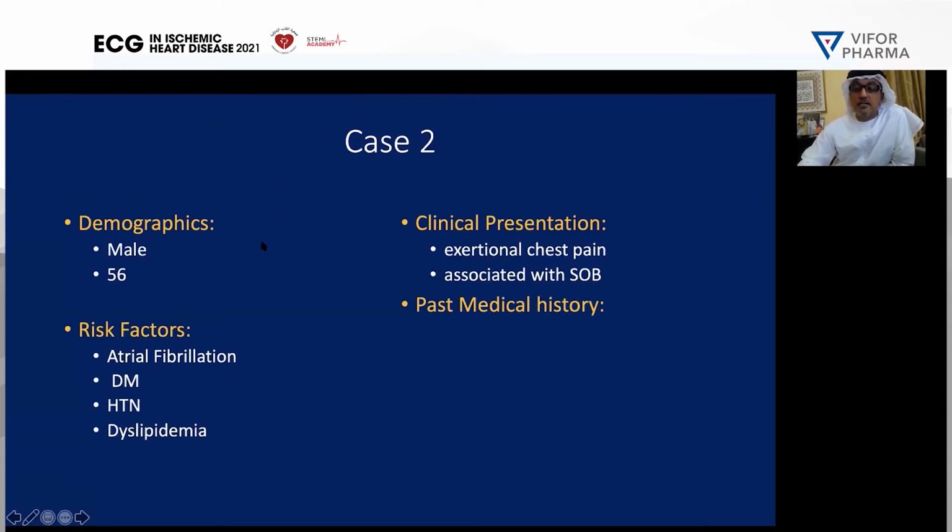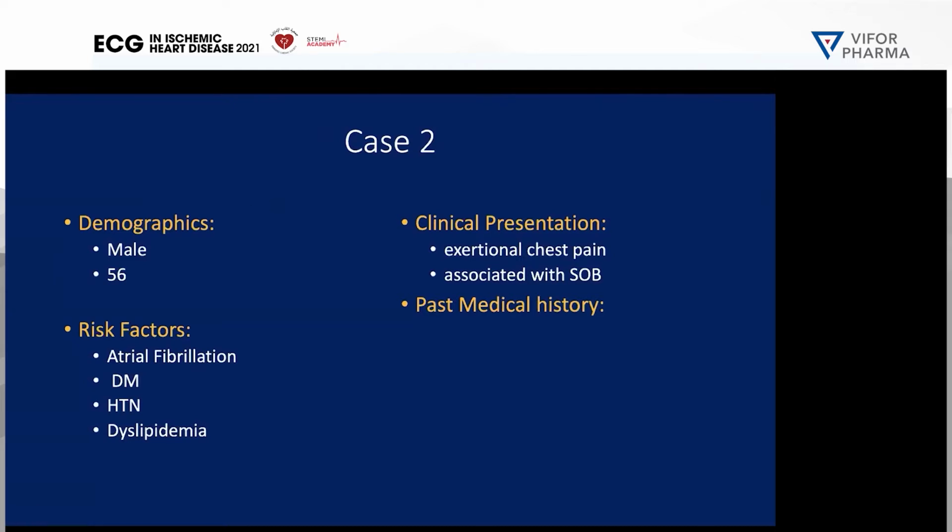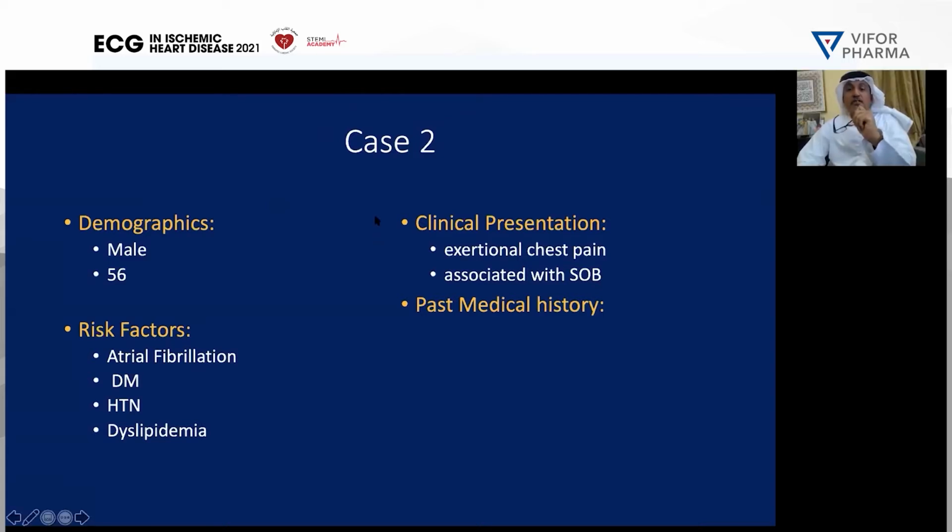So case number one, any message, Dr. Sharif? I think the take home message is: ST segment elevation, whenever there is any doubt, consider it as myocardial infarction and send it directly to a place where there is a cath lab, if available. Dr. Zubaidi said 90 minutes, you have to finish. If it is a little bit far from the hospital you are in, you have to do it in about 120 minutes. What do you think, Dr. Zubaidi? Yes.